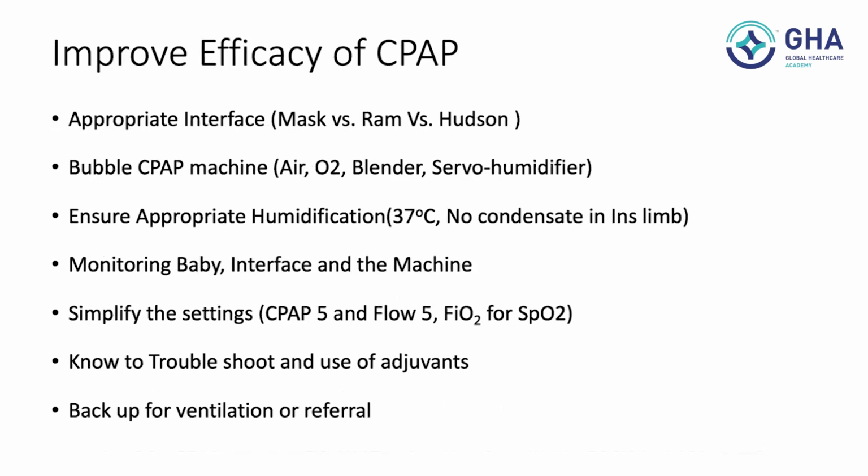On average, you can see in your unit, if your failure rate is more than 15%, there is always a chance for us to improve on the delivery of CPAP in our babies. You need to work on improving the appropriate interface. All 3 are good, but what you use, you continue to use to develop expertise in this. And prefer to use bubble CPAP machine because it's easy and cost effective.